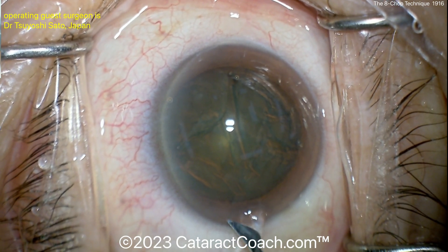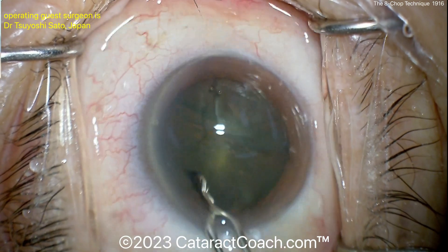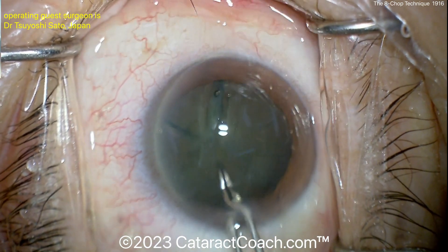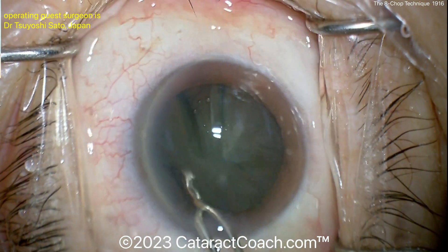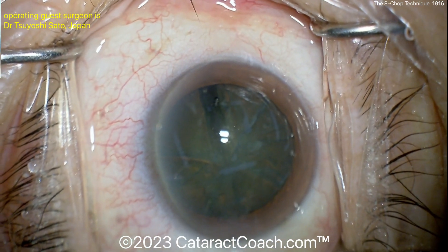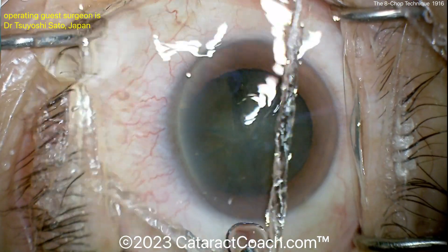There comes the pre-chopper — you can see its contours allowing it to go into the nucleus and split it in half. There's two halves. Now rotate, and there's a quarter, and another quarter — now you've got four pieces. Each of those four pieces splits again and again, giving you six pieces, then piece seven and eight. Now you've got eight pieces, each one-eighth of the nucleus, and notice there's no second incision — just the one main phaco incision.